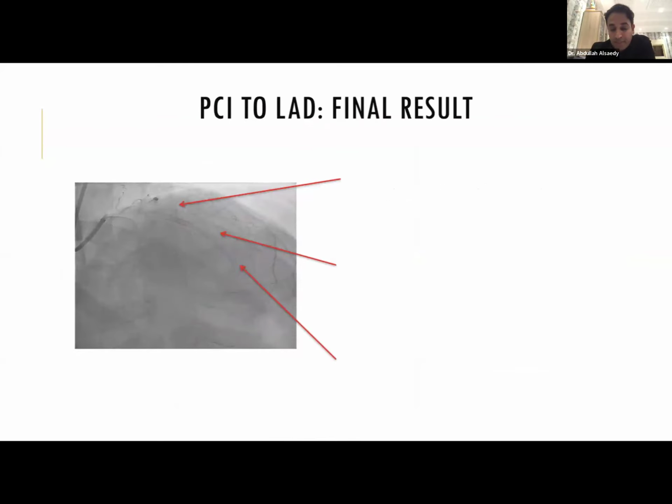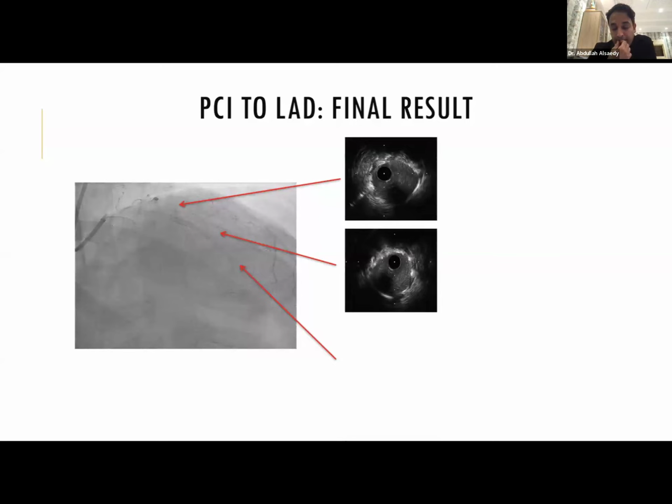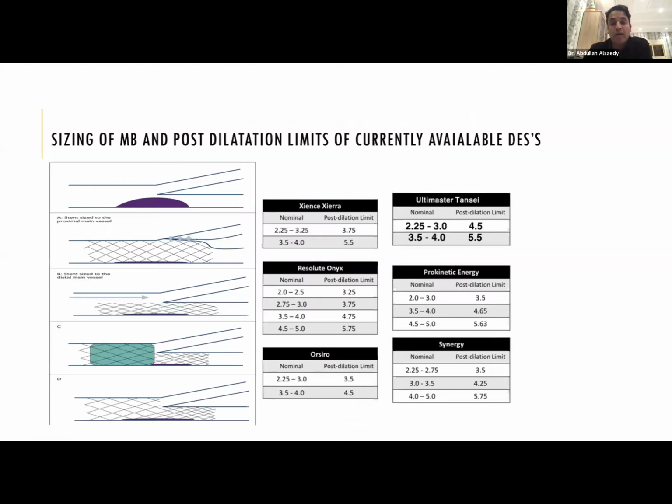We confirmed our stent optimization using IVUS, which showed good stent position and expansion in the first 3 segments. The mid segment needed another post-dilatation. We went also with a 3.25 NC balloon, and we got this excellent result.